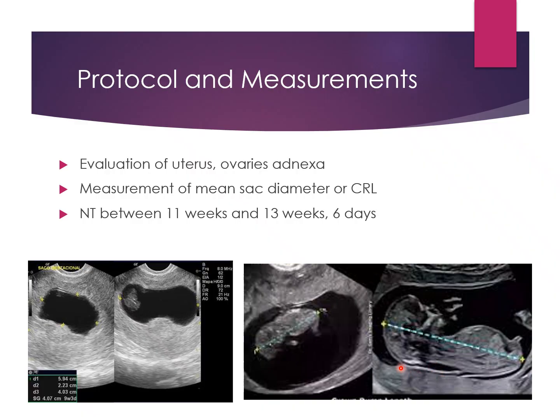And you can even kind of see it here. So do you guys see this fluid collection here at the posterior spine? That is what we're measuring. So we'll put a caliper here and we'll put a caliper there, and measure to make sure that that is within normal limits.